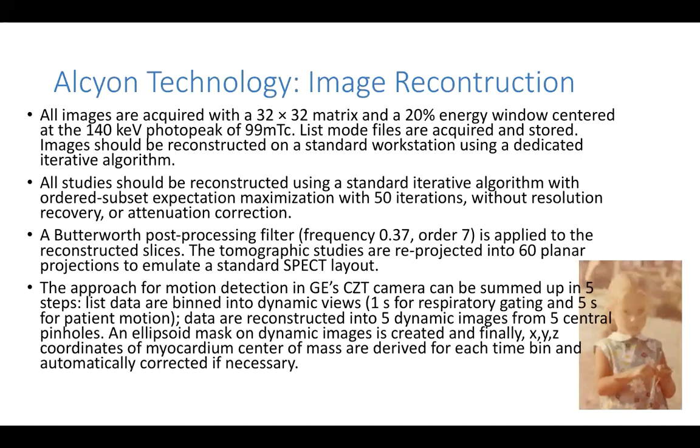What about the acquisition protocol? As for the SPECT, the targeted estimated total number of myocardial counts is usually set between 0.7 and 1.4 million counts for low-dose MPS, and between 1.2 and 1.8 million counts for high-dose MPS acquisition in a one-day protocol. And what about image reconstruction?